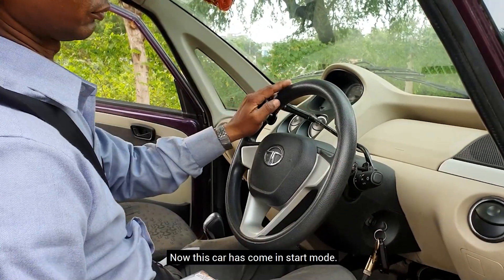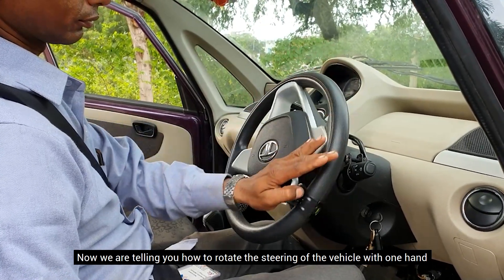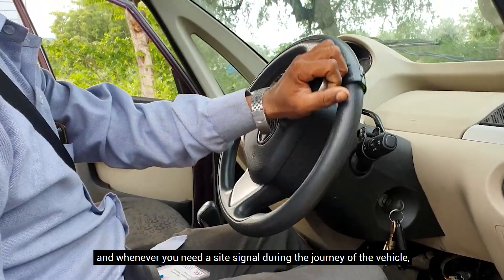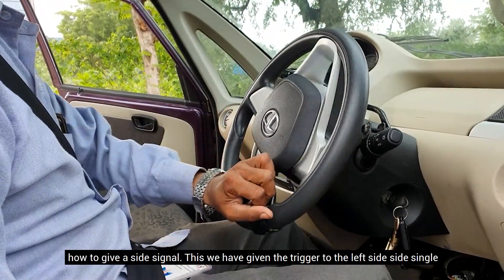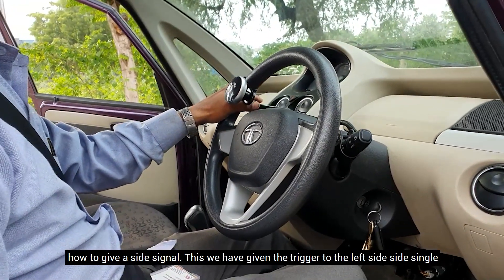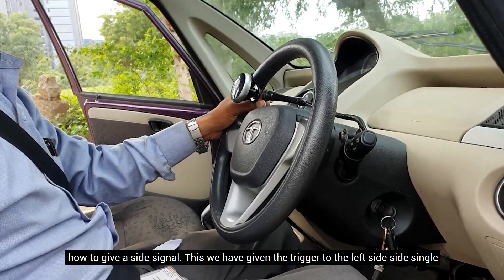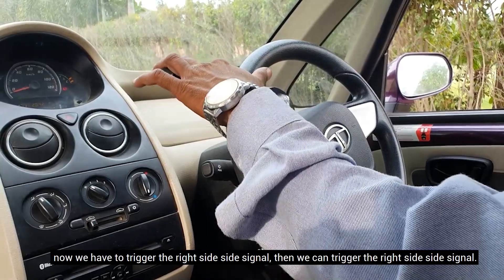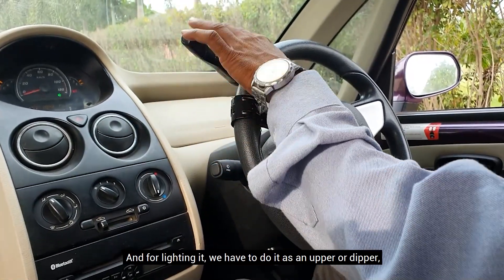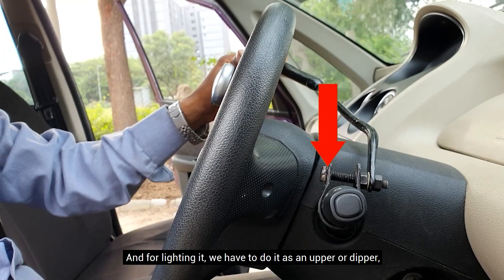Now the car is in start mode. Now, with the steering wheel, here is how to drive the car. If you need the side signal, we have triggered the left side signal. Now we have triggered the right side signal, so the right side signal activates on the right side.